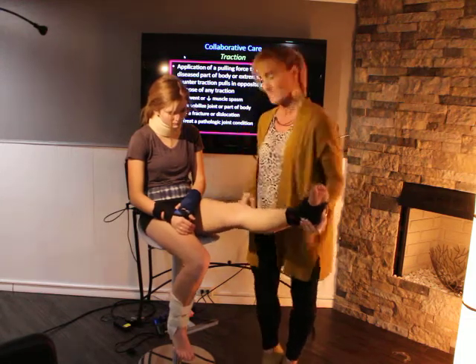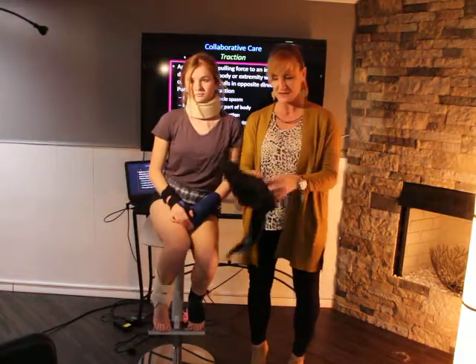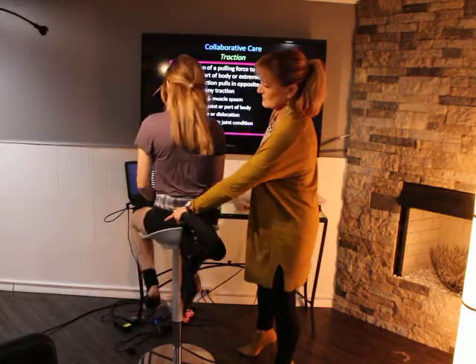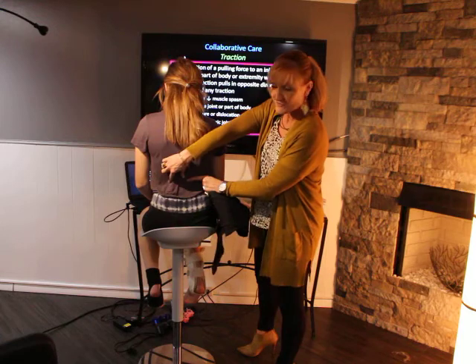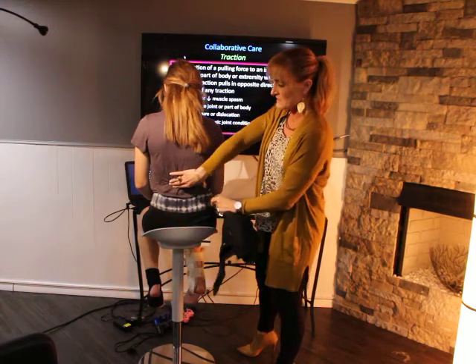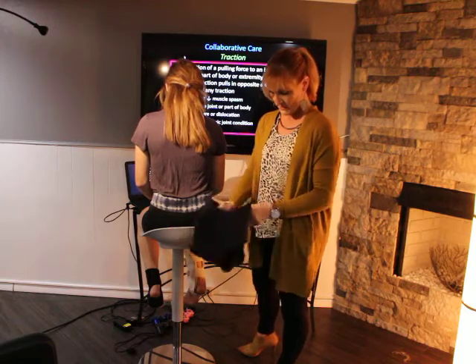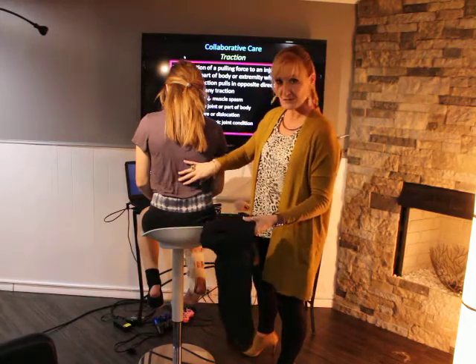The other thing, like a lot of your patients, and this is really common in nurses, is to have back strains. Back strains are these big, your two big back muscles right in here can get very damaged very quickly, especially by improper body techniques. And this is a very common area for muscle strain, especially nurses or anybody who's doing heavy lifting. You will notice if you go into Home Depot or places like that, a lot of people in there are wearing these to give the back some support.